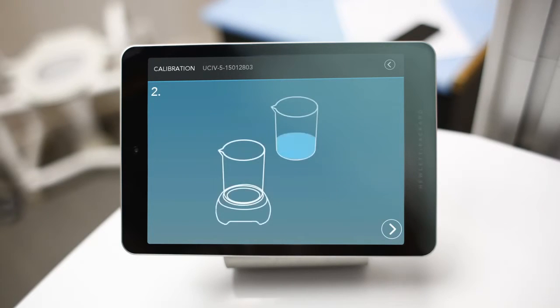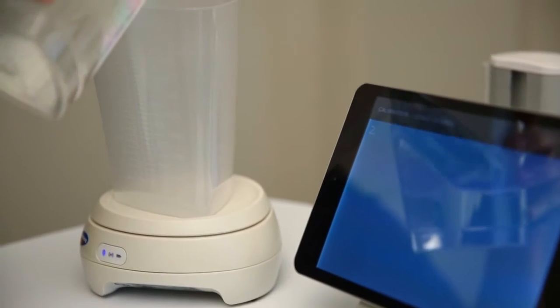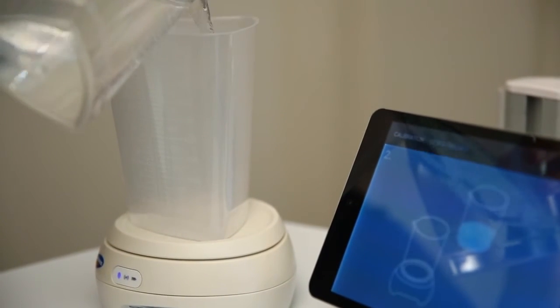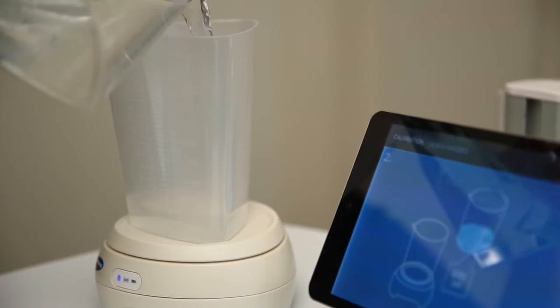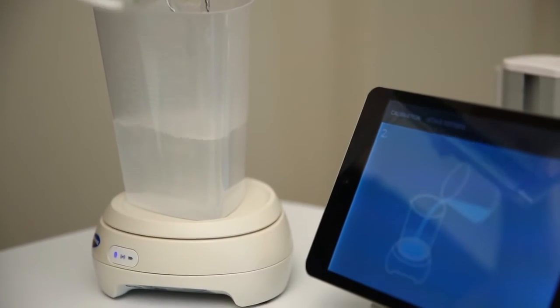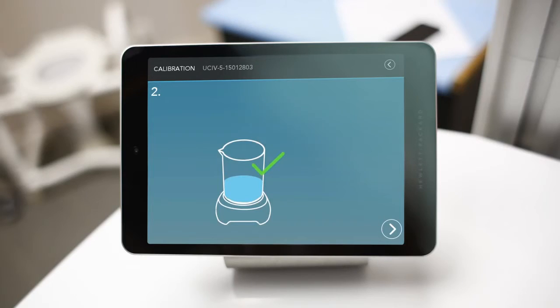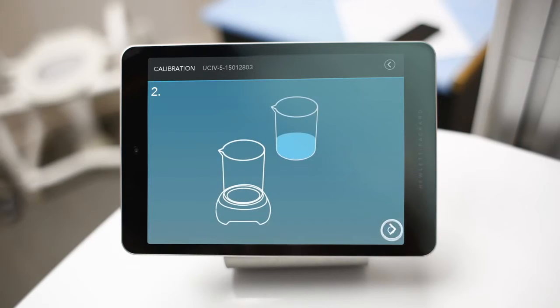Next, pour 500 milliliters of water into the beaker being careful not to spill. Once poured, tap the arrow icon in the bottom corner to complete the calibration.